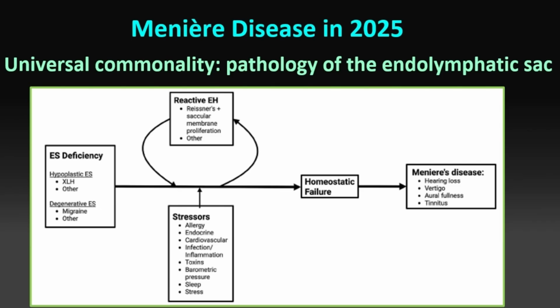And so it kind of pulls laterally as the sac develops, and along with it, the bony channel gets more horizontal. So now there's a way to figure out if someone actually had an arrest in development of the sac or not. Because if the vestibular aqueduct looks short and stubby and front to back, you can say, oh, it kind of got arrested in this fetal morphology, which corresponds with the underlying sac being hypoplastic.